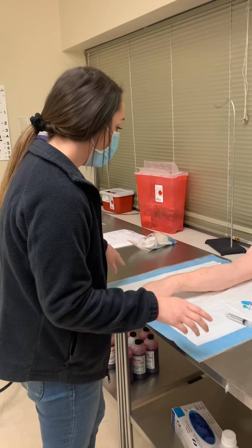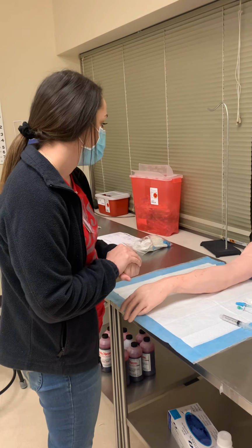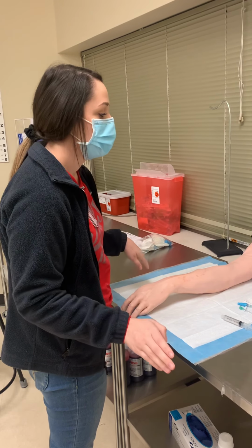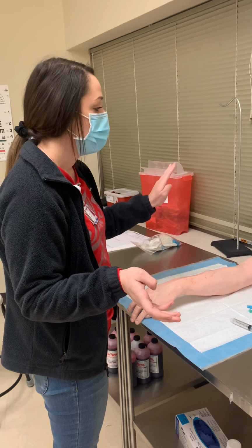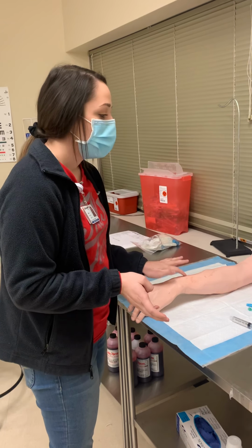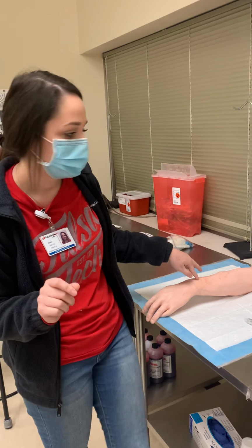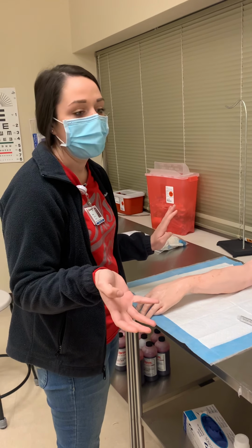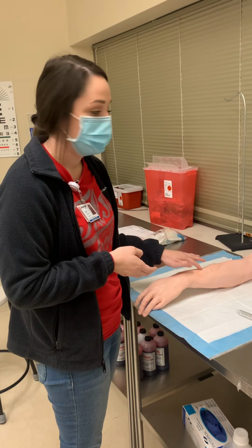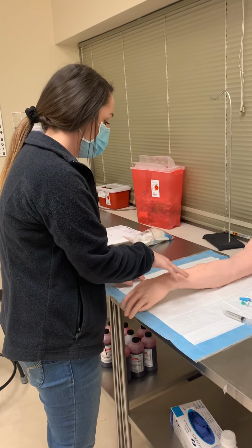Okay. So after I gather all my equipment and everything, I'm going to raise the bed up to a comfortable working height, place the patient in semi-Fowler's. If needed, I will change to a gown that is more easily accessible with snaps. I'll ask them about their preference of dominant side and where they would like the IV. I would then put on the tourniquet and check for places.